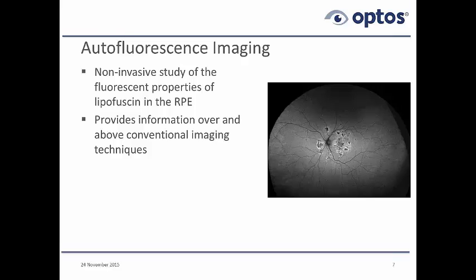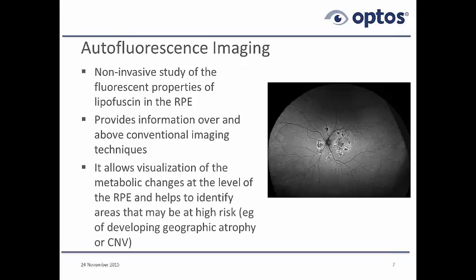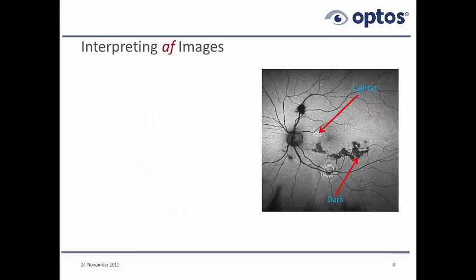And when the RPE becomes abnormal, so do the photoreceptors. And when the photoreceptors become abnormal, of course, that leads to a visual acuity loss, a visual field loss. And both of those are certainly possible. And we'll see examples of them.